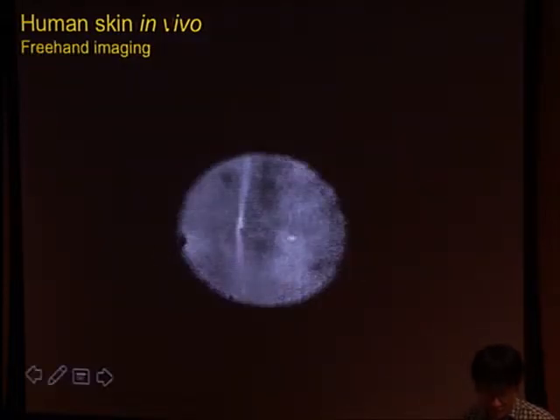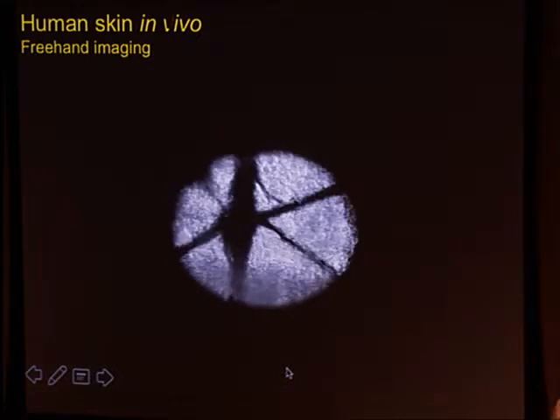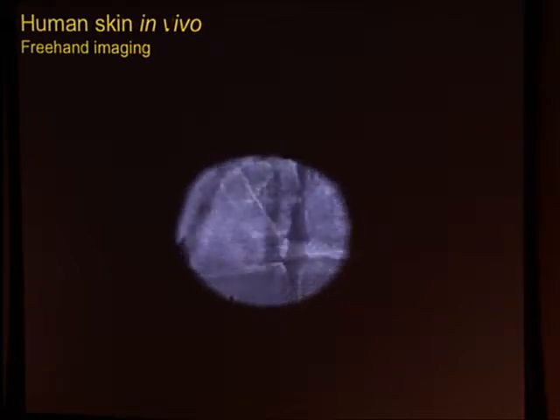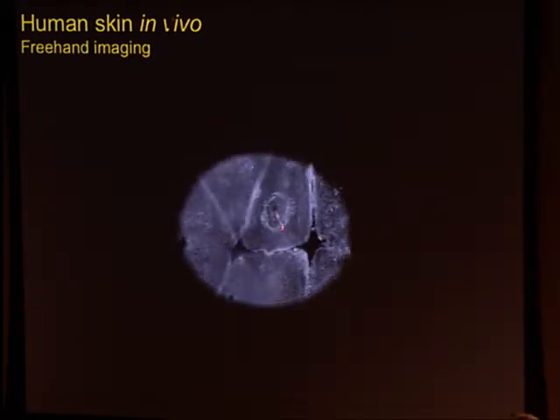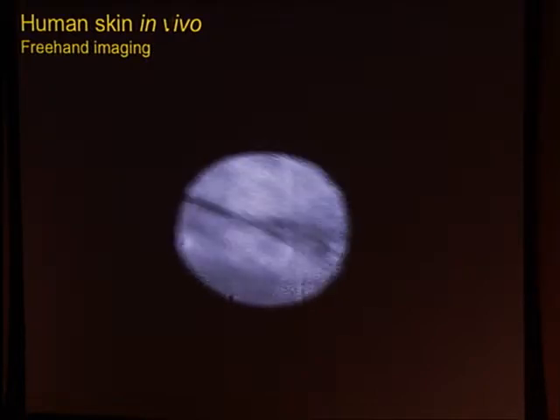With that, you can navigate around different areas of the tissue. You take a look at one location, go up and down, and for instance these are capillary vessels right there, and then melanin deposition, and if you come up a little bit, you get to see keratinocytes.